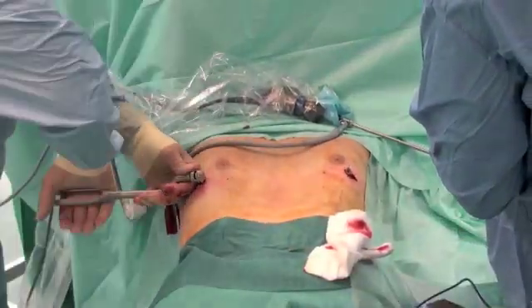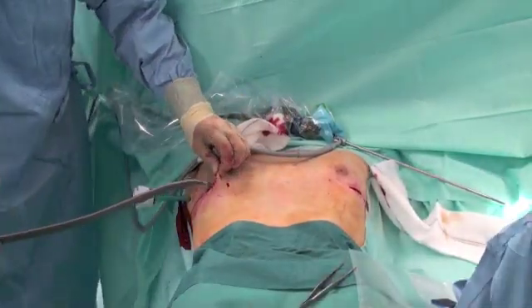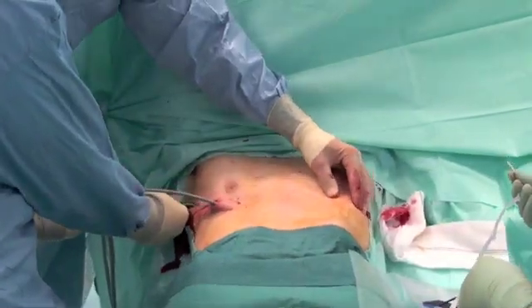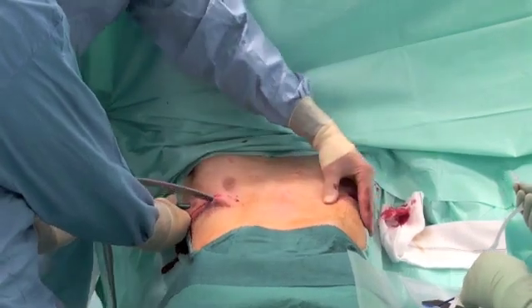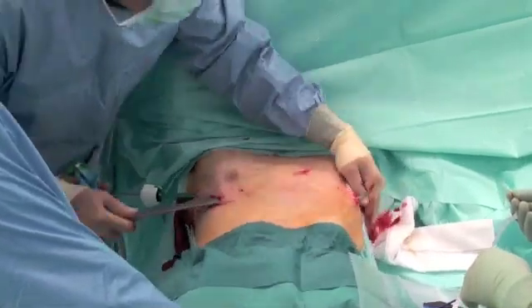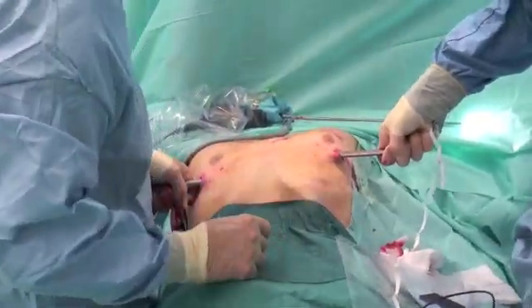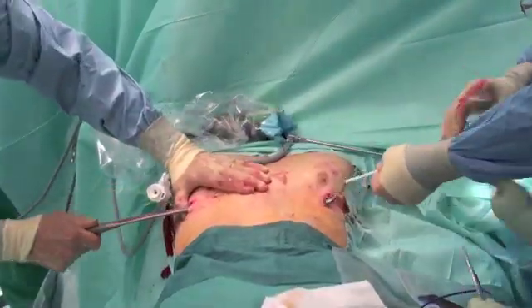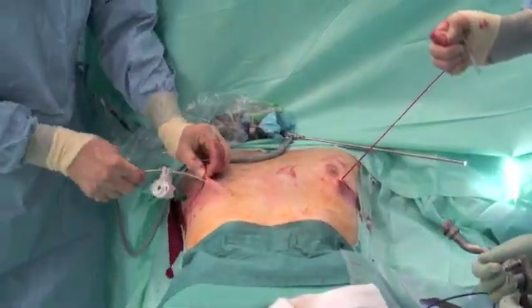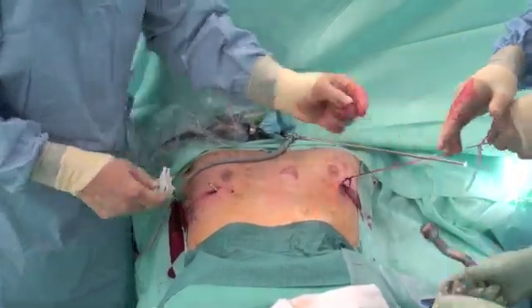Then we take the flipper and simply turn it round. You can already see that the pectus excavatum has improved greatly. In this patient it was decided to do two bars. The deeper part of the pectus is actually much easier to get round once you place the higher bar. If you have very severe pectuses, you place a higher bar first to make the second one easier. The second bar is a bit easier — again moulding the chest to reduce flaring inferior to the pectus. The procedure is repeated: placing a tape and then a pre-bent bar, and then it is flipped into place.